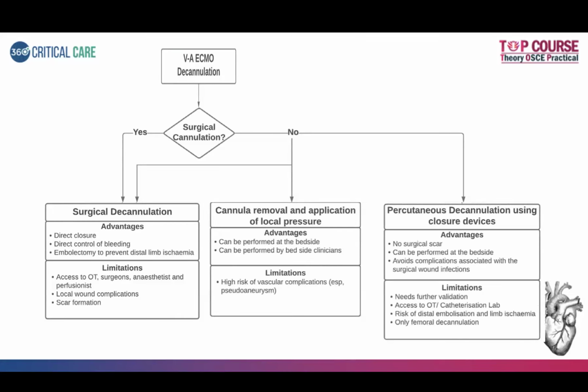The last one is, if percutaneous cannulation was done, then percutaneous decannulation can be done using closure devices. The advantage is there is no surgical scar, it can be performed at the bedside, and it avoids complications associated with surgical wound infections. But it has not been well validated, and it has been done mainly for femoral decannulation.